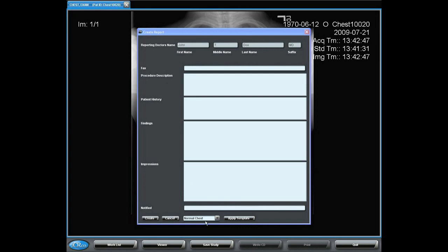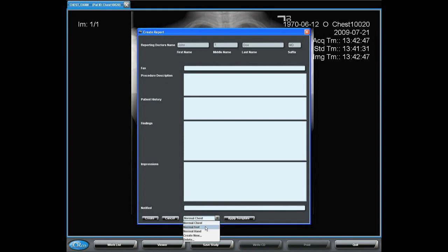And in this Create Report dialog, I can actually generate as many templates as I wish, and you'll see here that I have a few that I have already created. So, for this one, I'm going to select the normal chest, apply template.